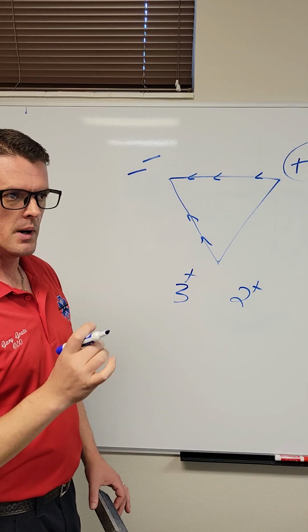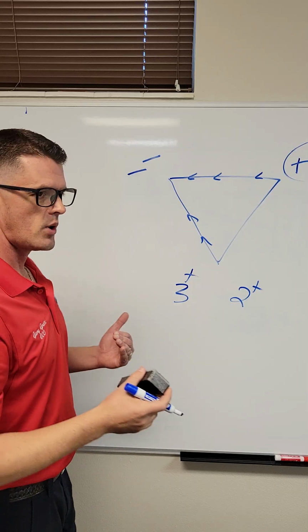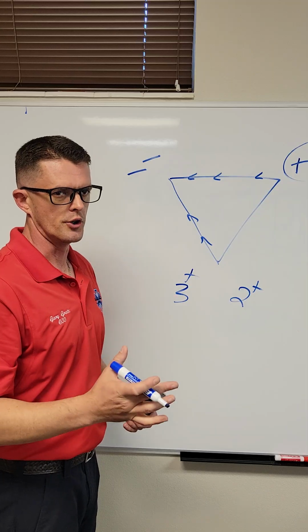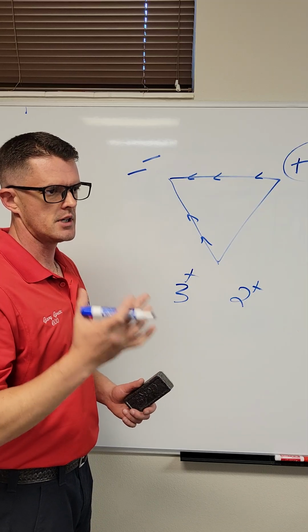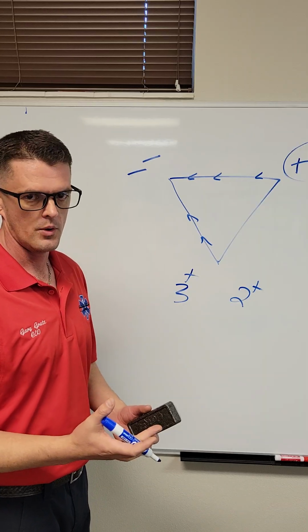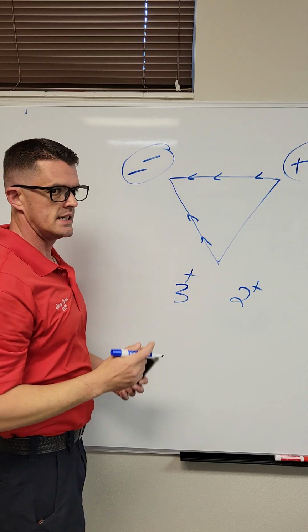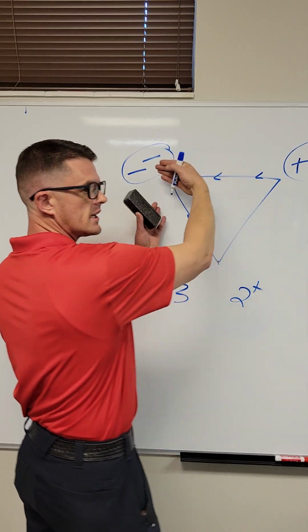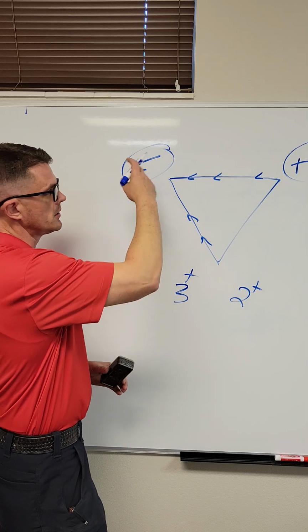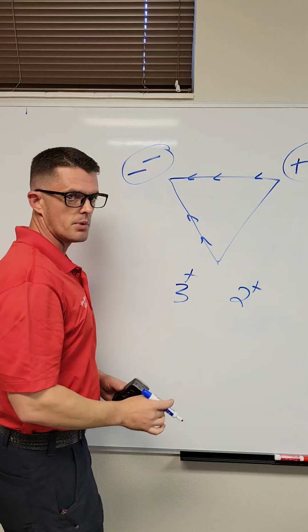What's important to remember about this is that sometimes you'll get questions, and on those questions, they'll literally ask you, in the right shoulder, is that a double positive, double negative, or a positive negative pole? And looking at this would be the right. Now you know it's negative. Why is that? Because literally everything is looking at it, okay? And I need a double negative up here, whereas the left shoulder is going to be your negative and positive.